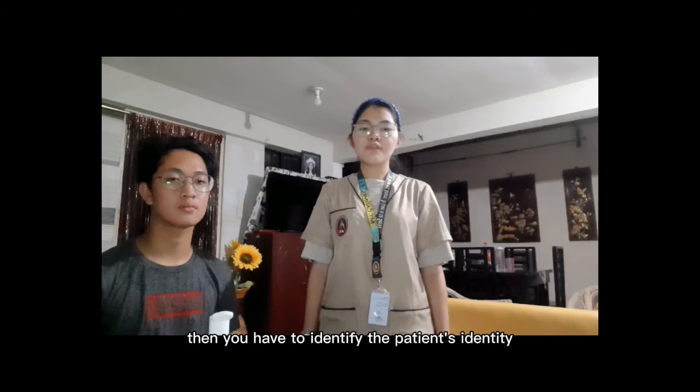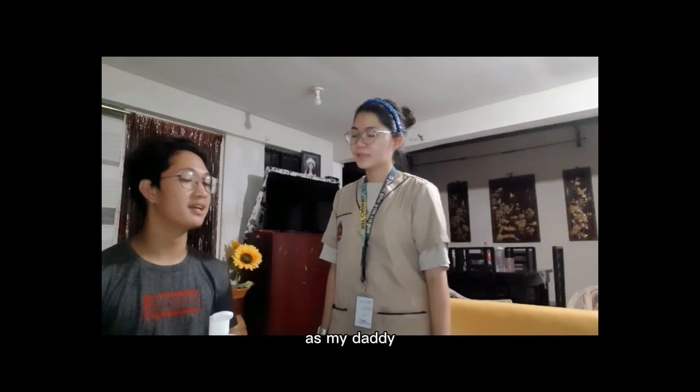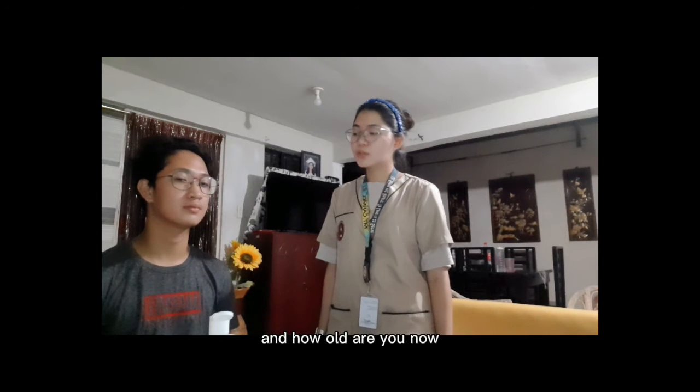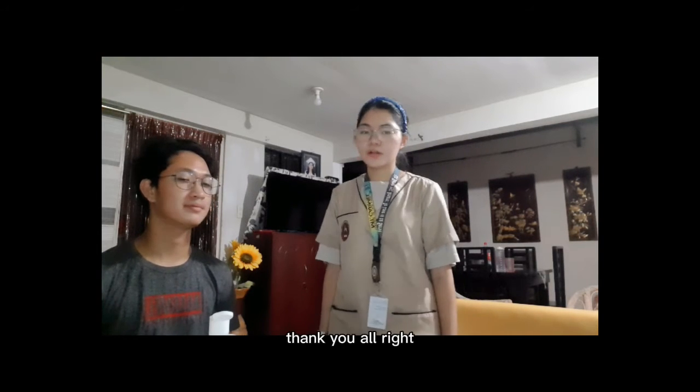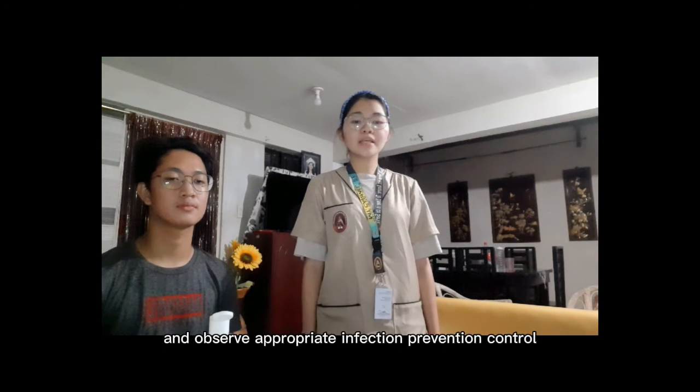Then we have to identify the patient's identity. So, sir, what is your name? My name is Maverick S. Madiari. And when is your birthday? August 12, 2002. And how old are you now? 19. Alright. Then we have to perform hand hygiene and observe appropriate infection prevention control.